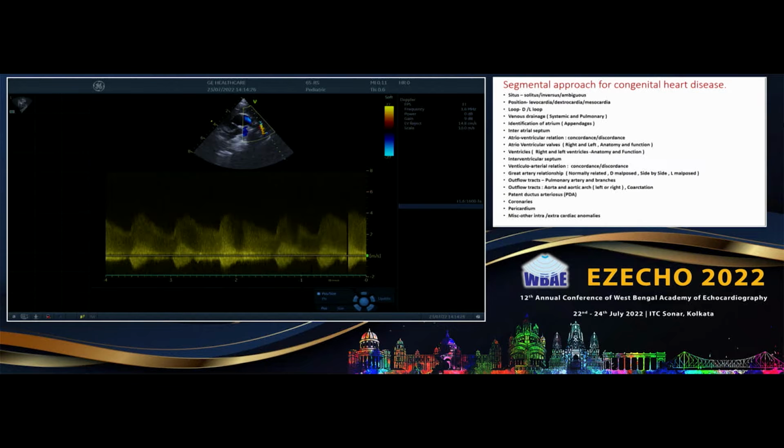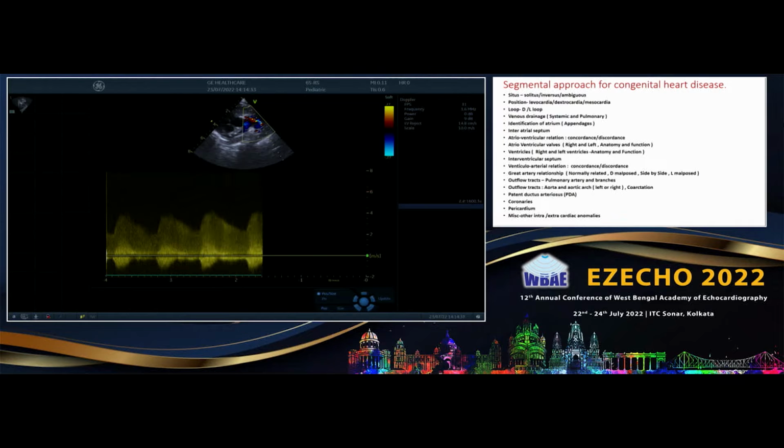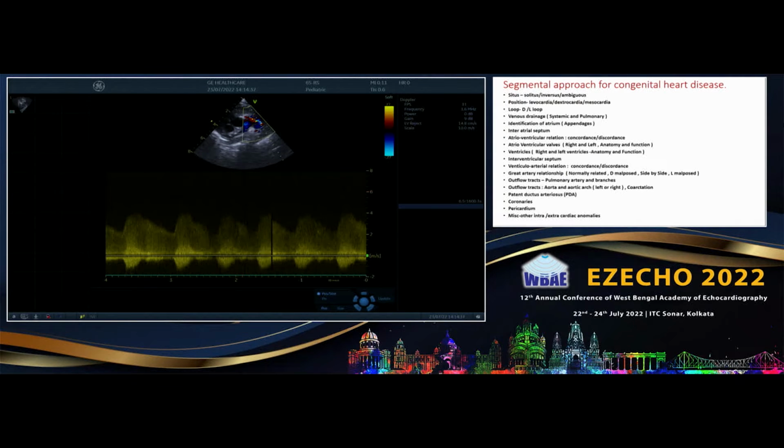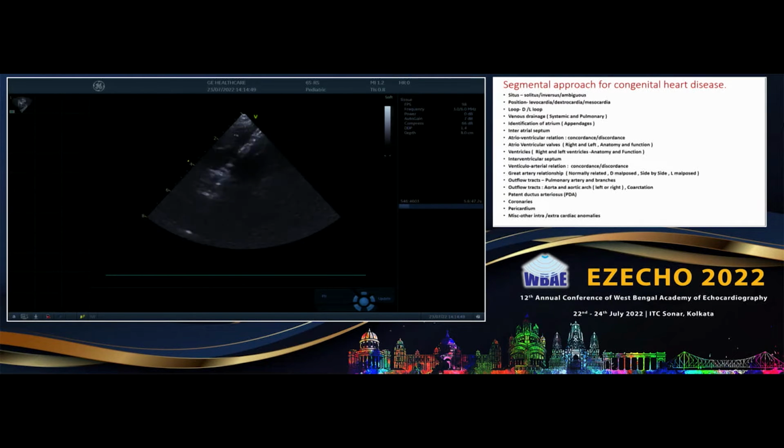I think it's a very good thing sir has told that we are missing a continuous murmur, so both ways, it's a continuous murmur of the duct. Now, Dr. Singhi, after please use the mic. Once the PDA is over, then we will go for the suprasternal view to look for the arch.